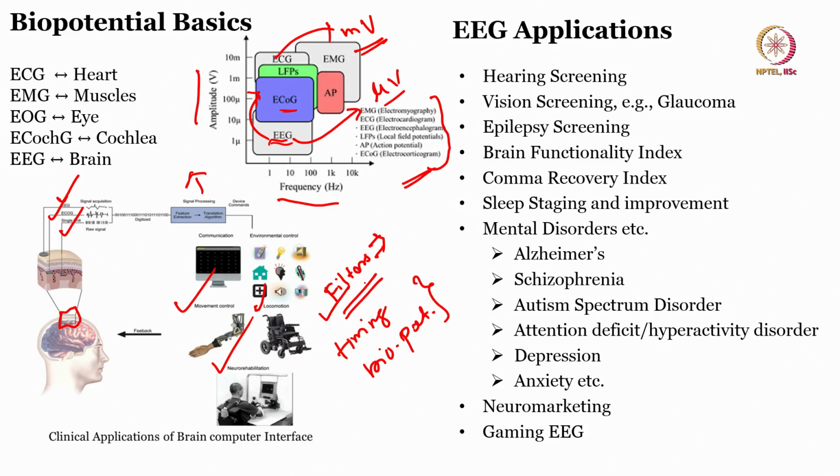All this is done on neuropotentials to make neural sense out of it, to get a footprint of your brain activity, your brain waves, whatever is happening. Using that you can check or modulate other parameters, like environmental control. This is like a BCI interface, or rather neuropotential based neurofeedback, because you are considering some form of EEG signature and then changing something.